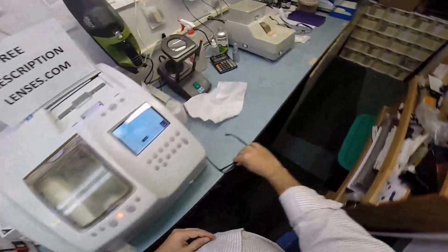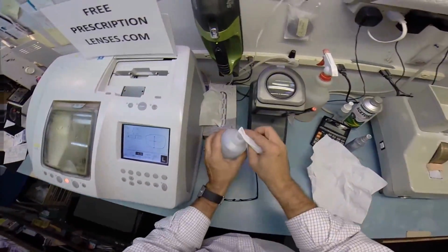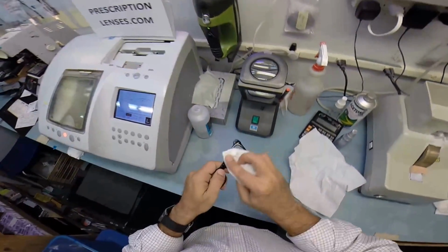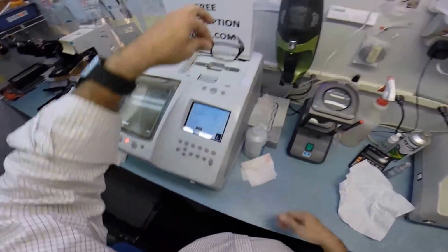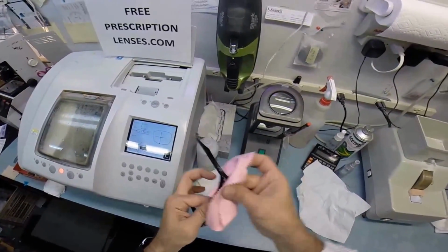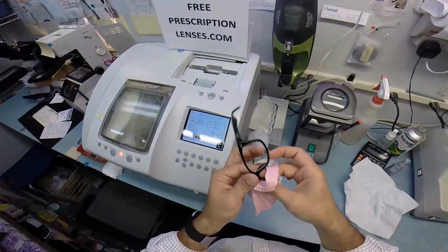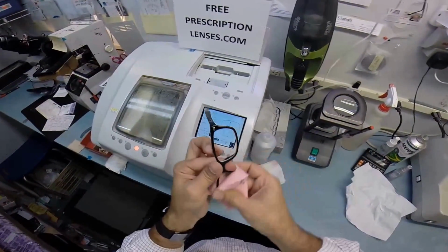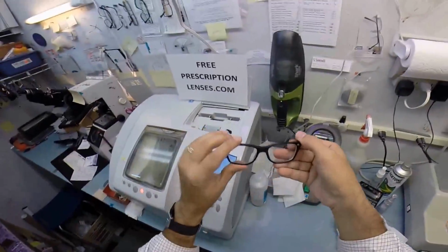I want to move over here, and of course in all my videos this is the time while I'm cleaning the lenses to tell you that should you get these in the mail and they're too loose or too tight, or one side is higher than the other, realistically that's probably what's going to happen. That's because 80% of people have one ear that's higher than the other, and that is why 99% of all optical shops will do free adjustments if you stop in. So next time you're near one, just pop in and get these adjusted, but only if you need to.